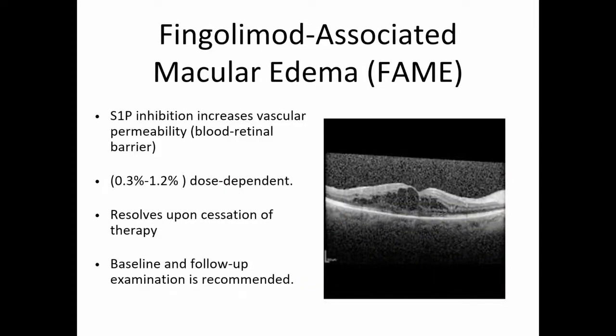The other use for OCT is that patients with MS can be on different treatments. One of them is fingolimod, and fingolimod has been associated with macular edema. So we can use OCT to screen for patients who have fingolimod-associated macular edema. It looks exactly like what you see with diabetic macular edema, and you can see these cystic changes of the inner nuclear layer. Once you stop the treatment, the edema goes away, and generally speaking, there's a recommendation to have a baseline and follow-up OCT for these patients.